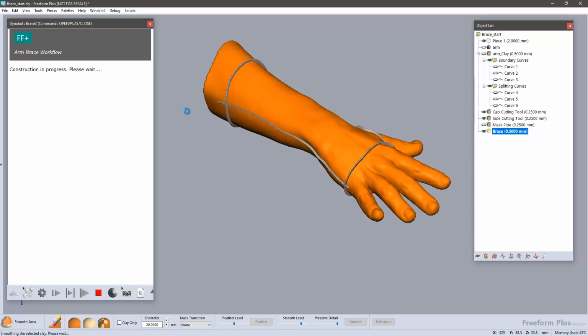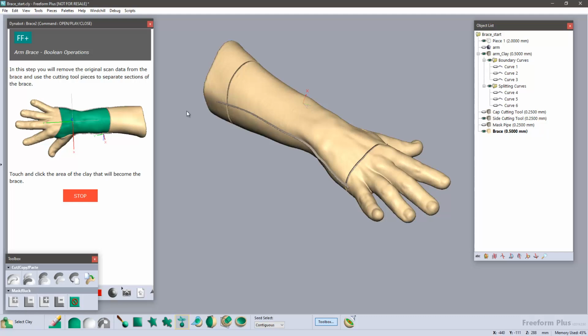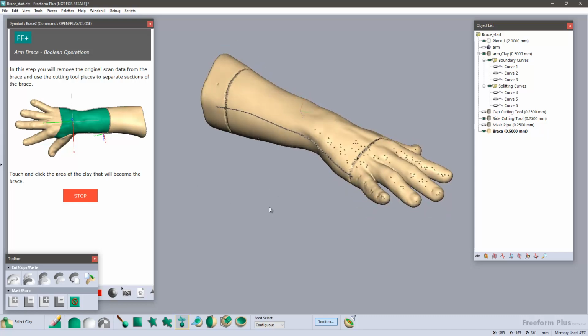Now it's smoothing, performing some Boolean operations. It removed out parts of the model. It trimmed using the cutting guides. And this step here has me click the area that is going to be the wrist brace.